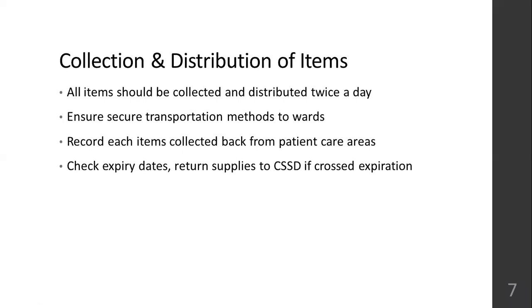Then collection and distribution of items: all items should be collected and distributed at least twice a day from the CSSD department. That's their protocol. Ensure secure transportation methods to the ward using CSSD trolleys, so that while getting it to the ward, it does not hit other articles and the things inside do not fall off.